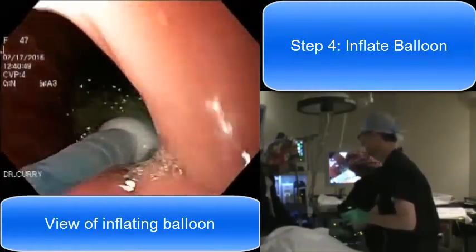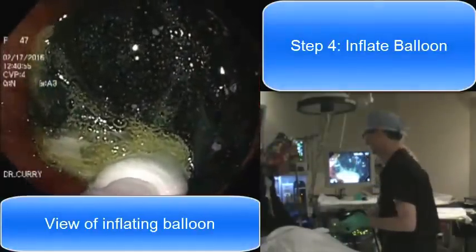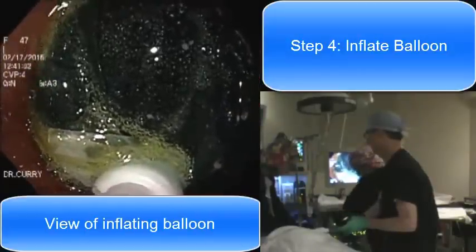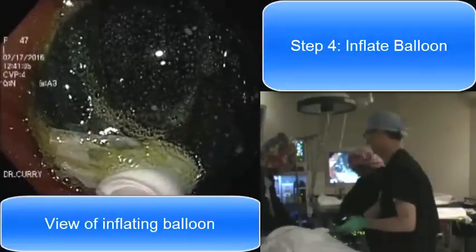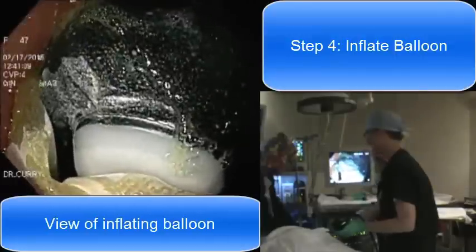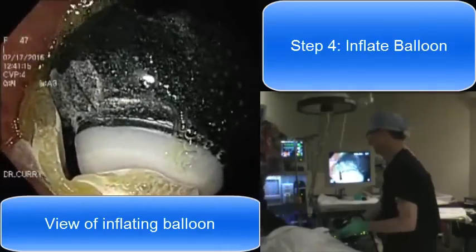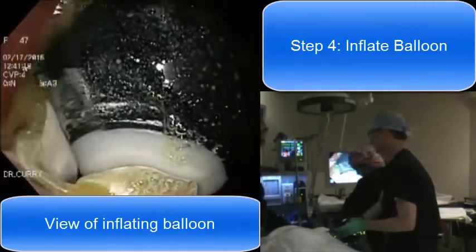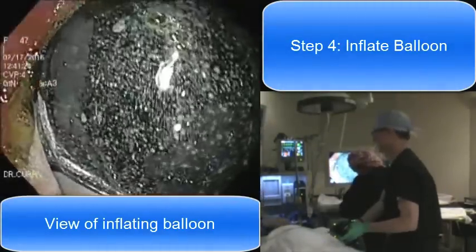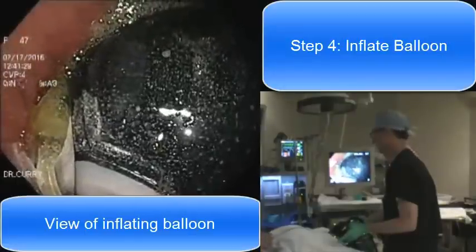My job is to keep the scope centered on the balloon so we can watch it and make sure it's inflating in the right spot. You wouldn't want it to drift down into the small intestine where there wouldn't be room to fully inflate it. The balloon is designed with a wrapper around it that keeps it rolled up during insertion. You can see that membrane peeling loose from the balloon, allowing it to inflate. That membrane stays attached to the catheter so when we're finished inflating the balloon, we can withdraw the catheter and the membrane comes out with it — it does not remain in the stomach or attached to the balloon in any way.